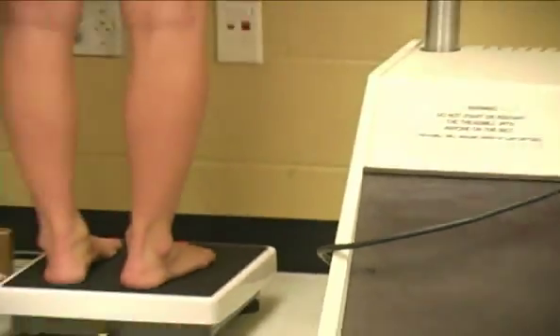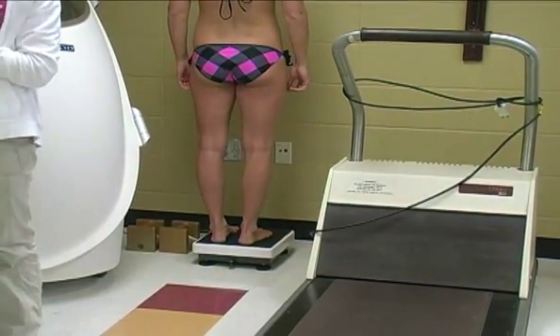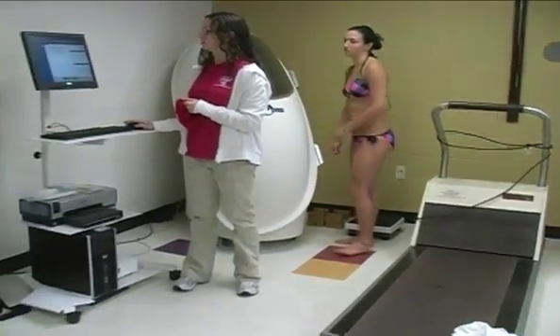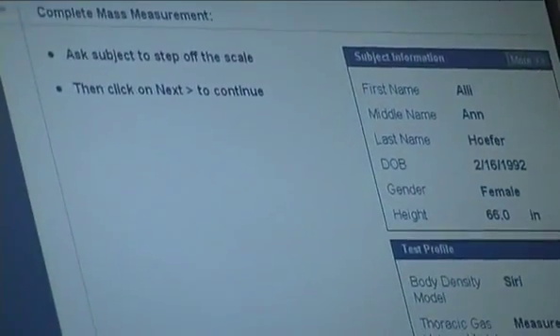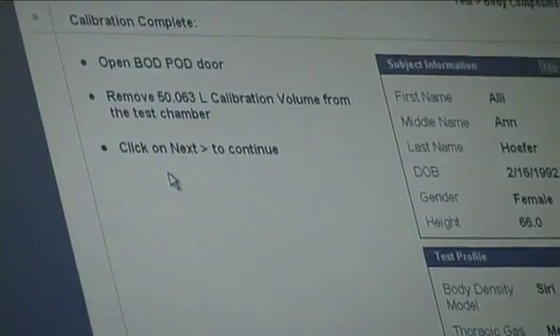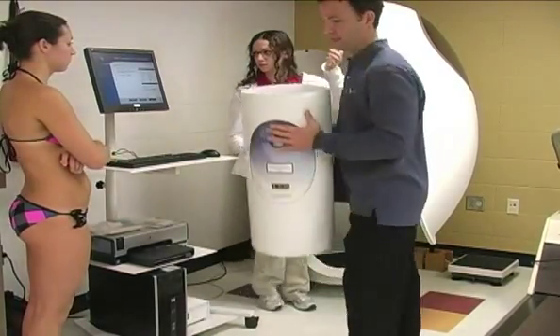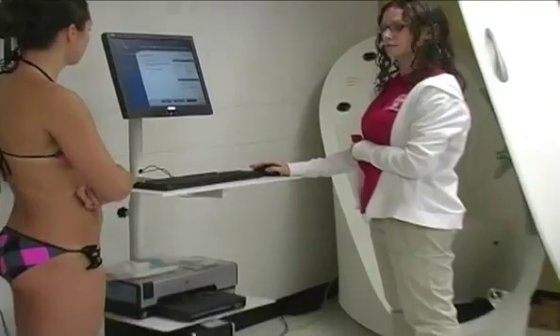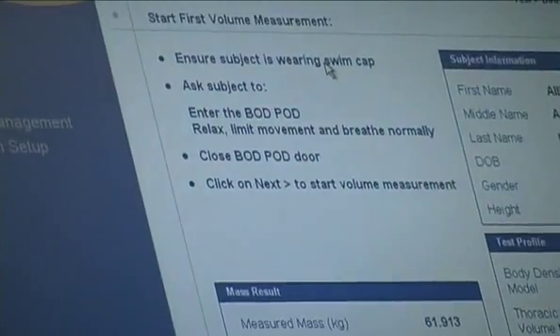Step on the scale and stand still. It'll be about 5 seconds. Okay, you can step off. So it tares, zeroes out once again. Okay, so now we're gonna open the door and take out our known volume. And here's the cap. So this is where we're gonna make sure she's wearing the cap.